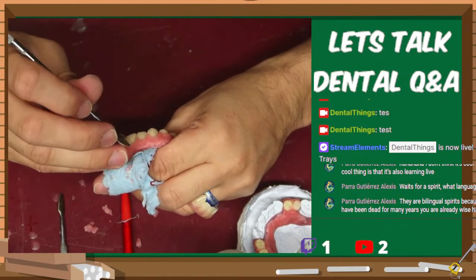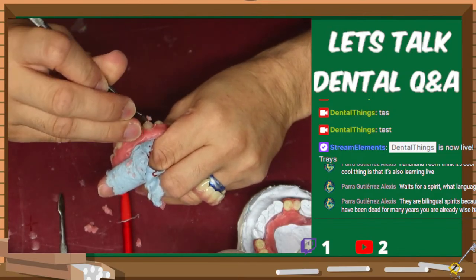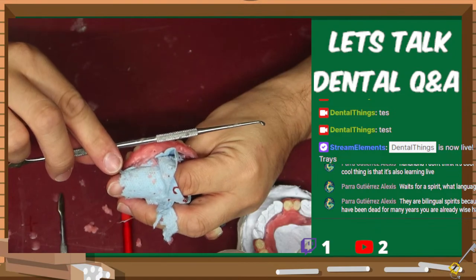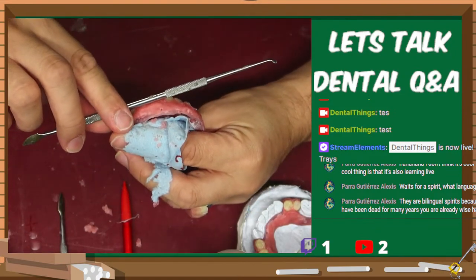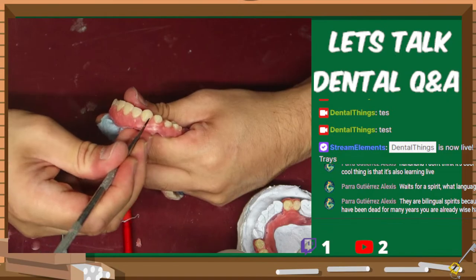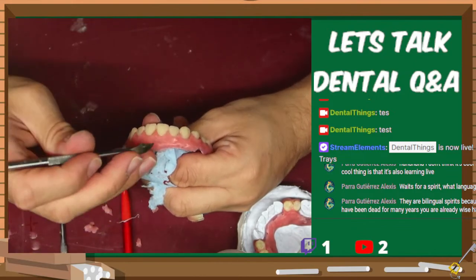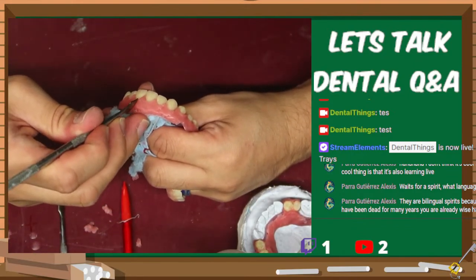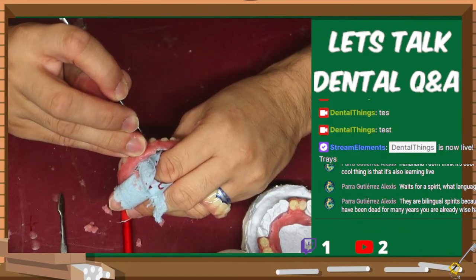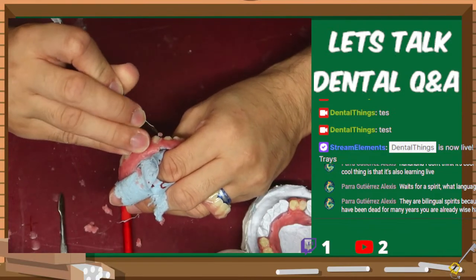And let's just start matching the next one, or all the way over there is canine, little by little. Okay, just about. I can probably go a little bit higher, but let me go and feather out what we got going on over here. Cool. Continuing on over here to the premolar, tooth number 5. I went a little bit too high right there, but I'll add some wax later and fix that up a little bit.